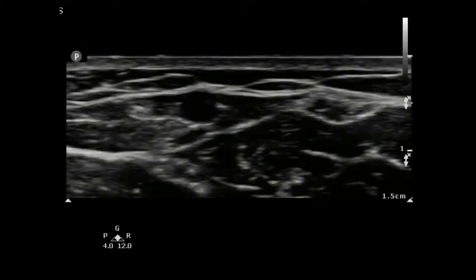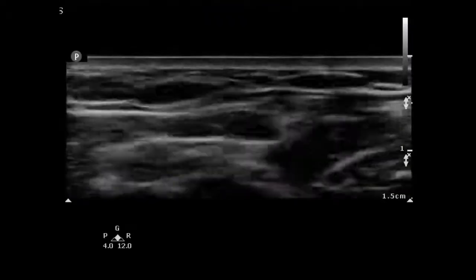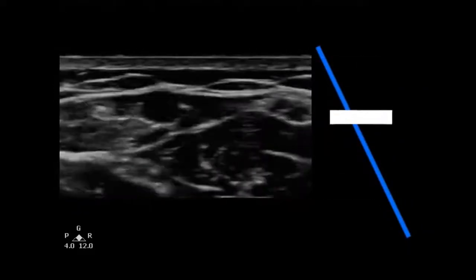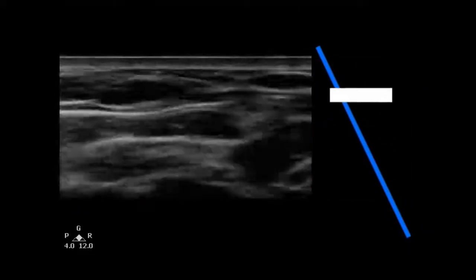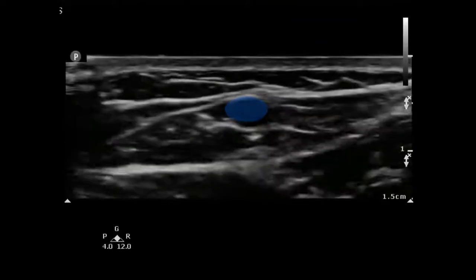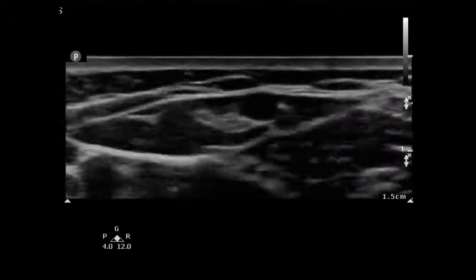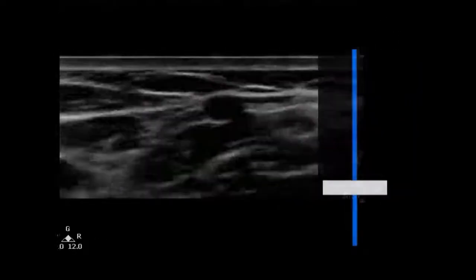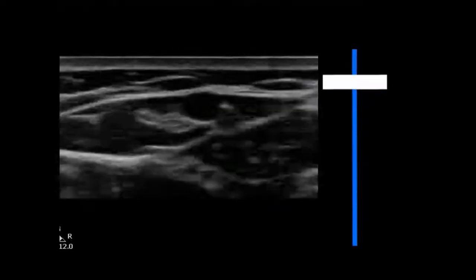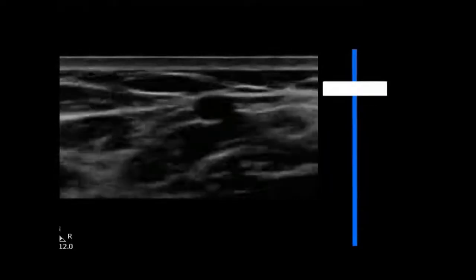How do you know if you're on axis or not? Here's a picture of a patient's arm. There's the vein, and as I move up and down the patient's arm, the vein moves back and forth across the screen. The reason for this is my ultrasound transducer is not in the same axis as the vein. Here's what it would look like if you were on axis — I'm moving up and down the patient's arm and you can see that the vein stays right in the middle of the screen. That's where you want it, because as you perform your venipuncture at a 90-degree angle to the transducer, you know you're in the right axis.